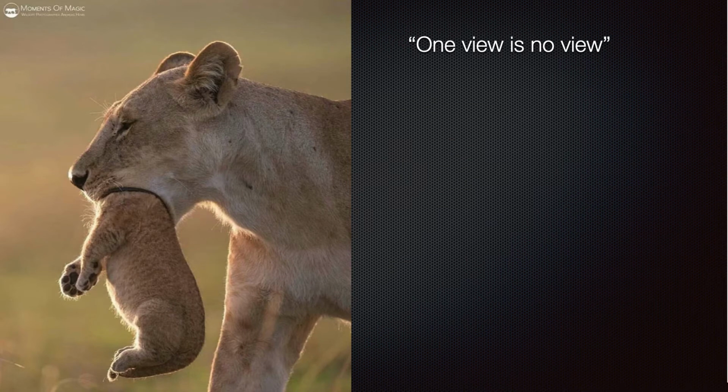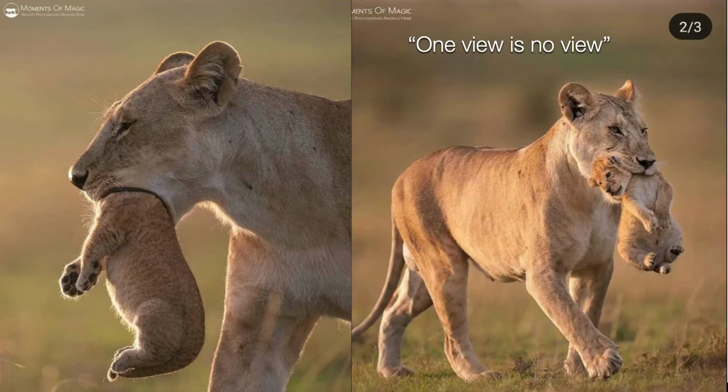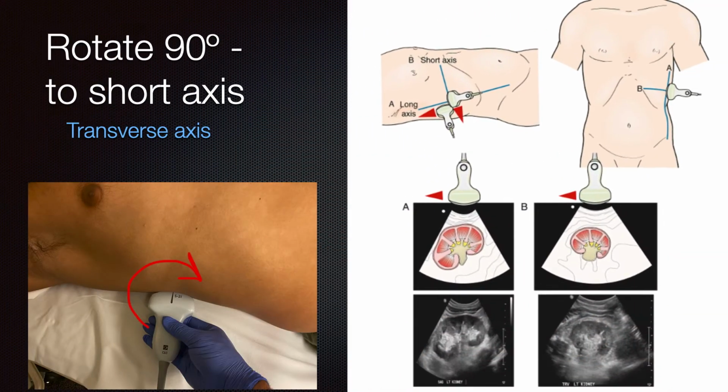So we always talk about one view is no view. What looks like a tragic situation here of a mother eating your young is actually a sweet routine little procedure of her just transporting her young kitten probably back to the den. So always get two views to really understand what's going on. And in the spirit of that, we're going to take this coronal view and the longitudinal view actually of the kidney, and we're just going to rotate here to the short axis of the kidney 90 degrees.